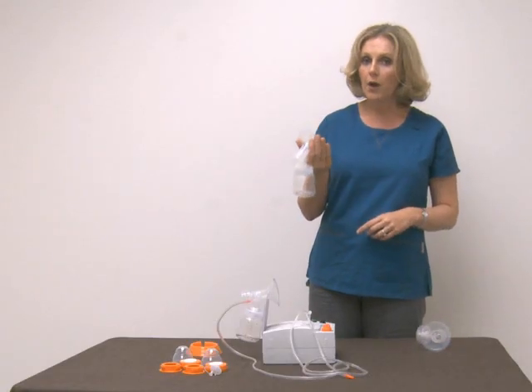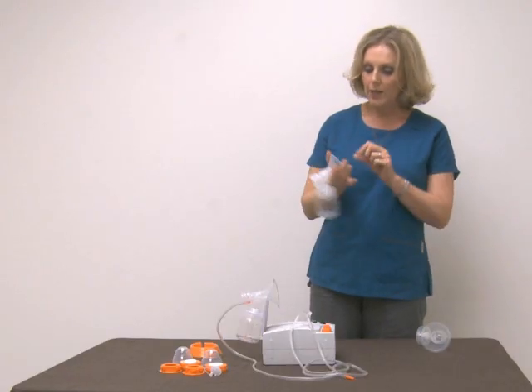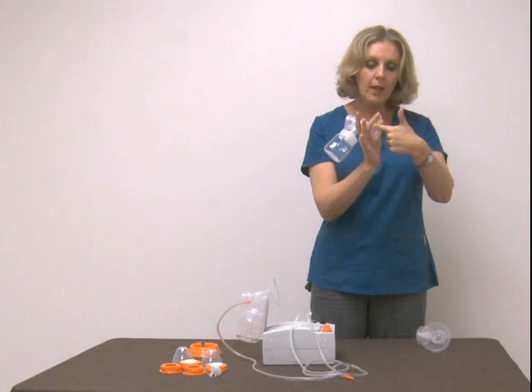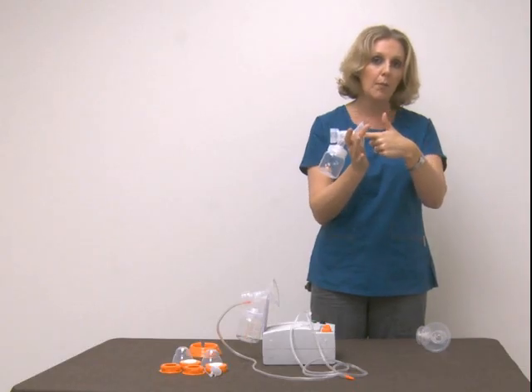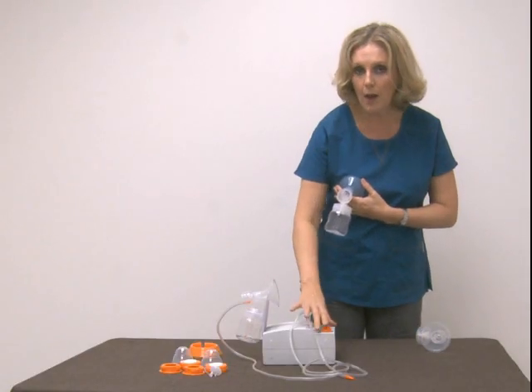But if you start off like most women — this is the most common size, which is why it's included with the pump — and you still have room, meaning your nipple goes in and there's still space before even pumping, then start here and go ahead and pump.